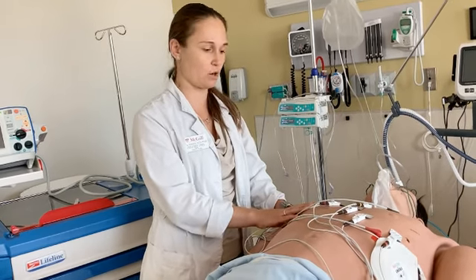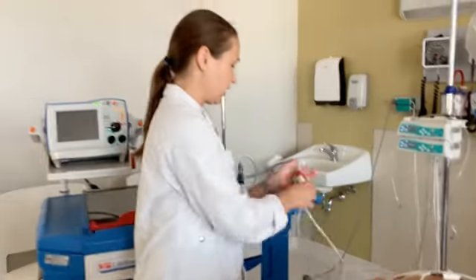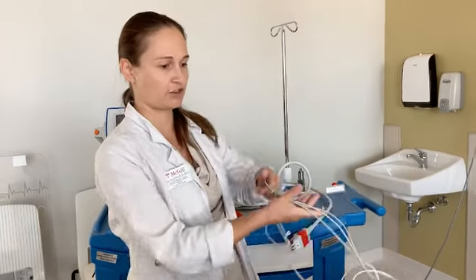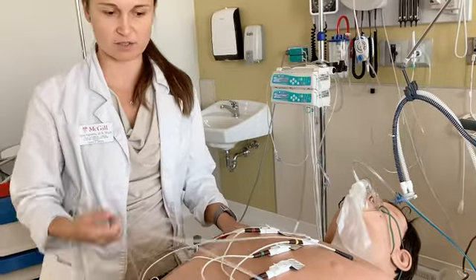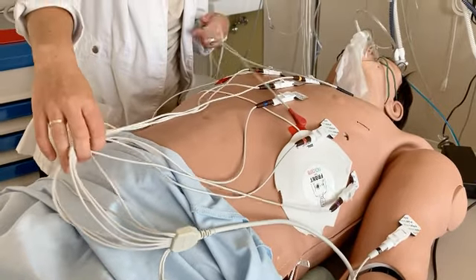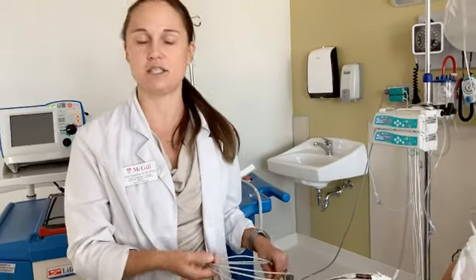That's also another option. I have made sure that my pads are connected to the defibrillator. I also have a 3-lead electrocardiogram that is done by the defibrillator going to my patient's chest. It's all connected. I also have a 12-lead electrocardiogram connected to the patient, and I am recording everything with my EKG. The recording is done continuously, which is the best practice, so we can analyze our interventions later.